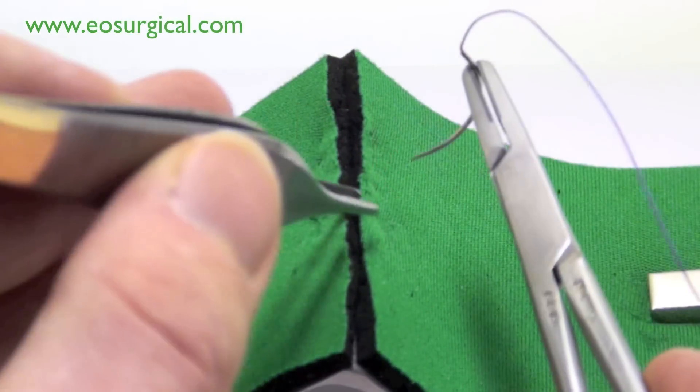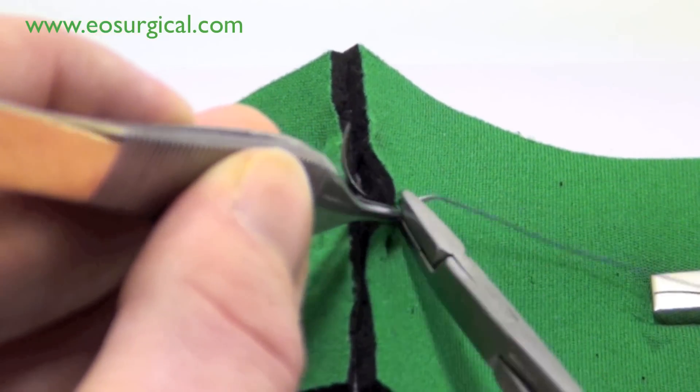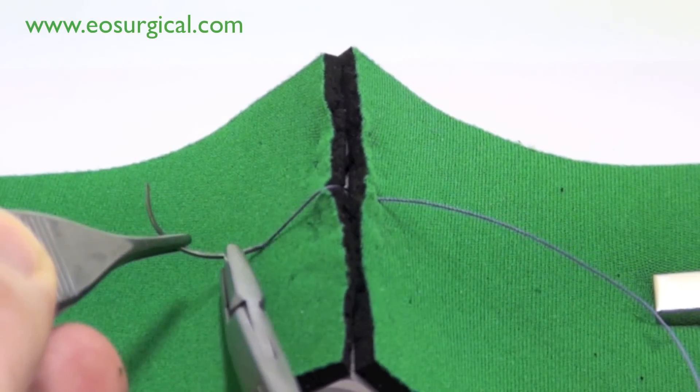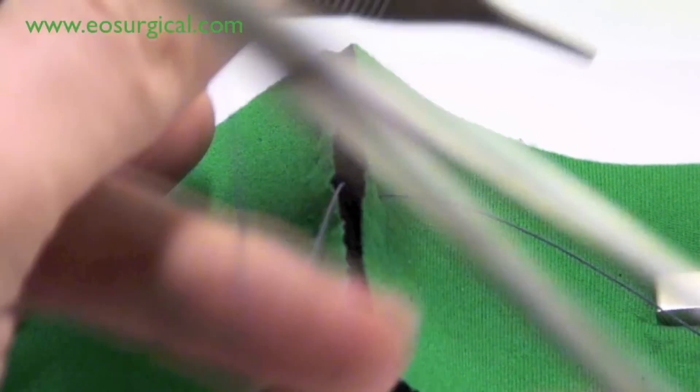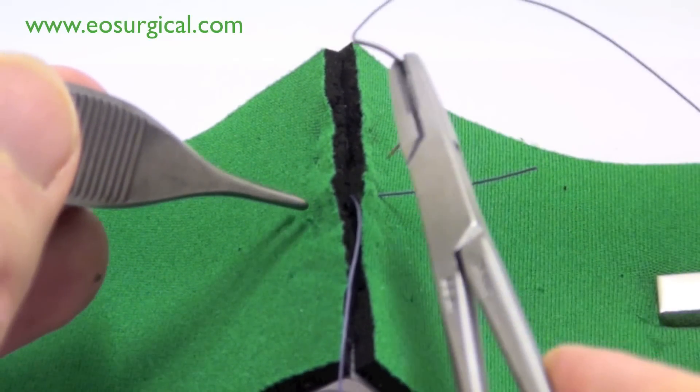Now let's look at this on the simulator. This is the needle entering the tissue at point A. Note how the needle is curving through the tissues and following the curve on the needle itself. This causes a minimum amount of tissue damage.